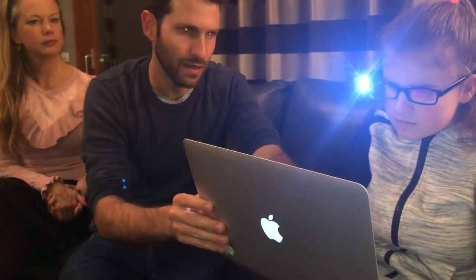If you're using the activation with the sidebar, it takes a picture of the whole page. But say you want to read only a certain part of the page, not all of it — you can take your finger and point it towards the screen. You will hear a beeping sound.